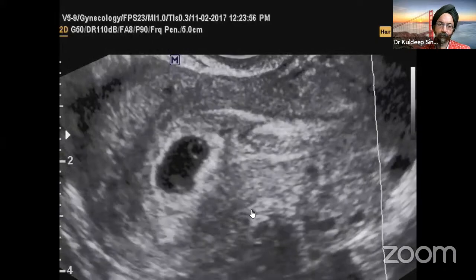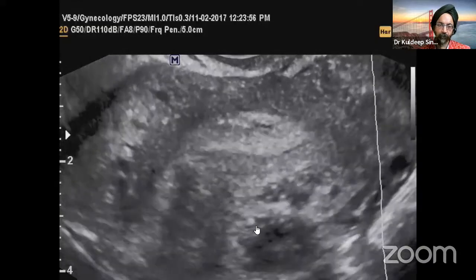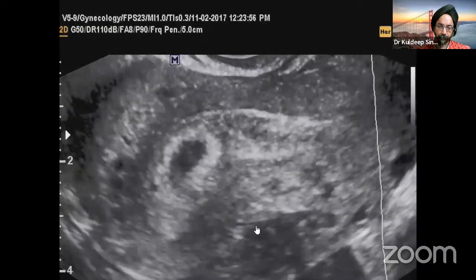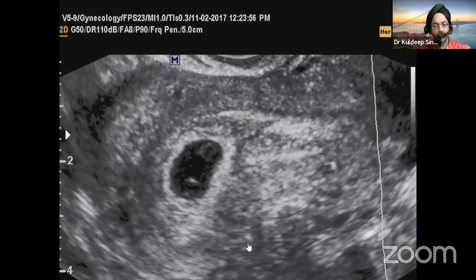How many gestational sacs are we looking at? And how many yolk sacs are we looking at in the gestational sac?